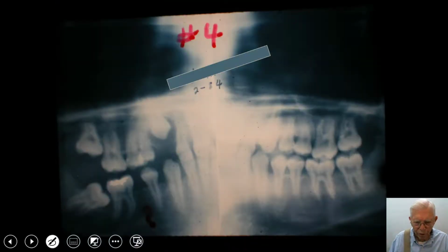Now we'll go to the following. This is 84. In other words, we waited around for this to happen. Well, instead of this tooth setting up this way, the thing just lay down. It looked like it just went to sleep over here. And this tooth is in the way. We moved this over some, and that tooth just lay down like that. It's going to be a pretty big problem if we didn't know how to upright it.